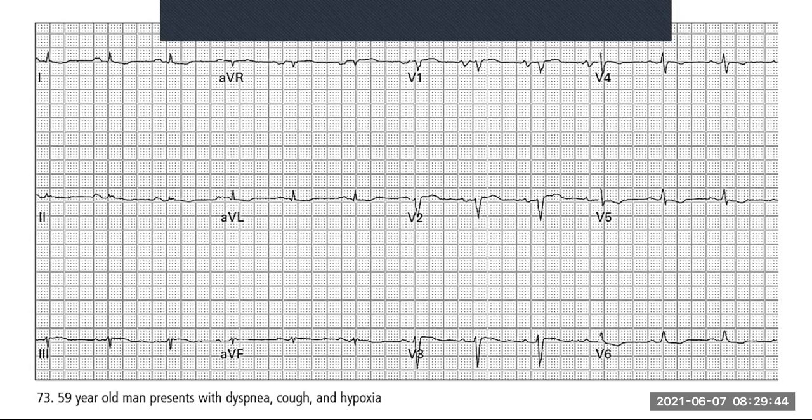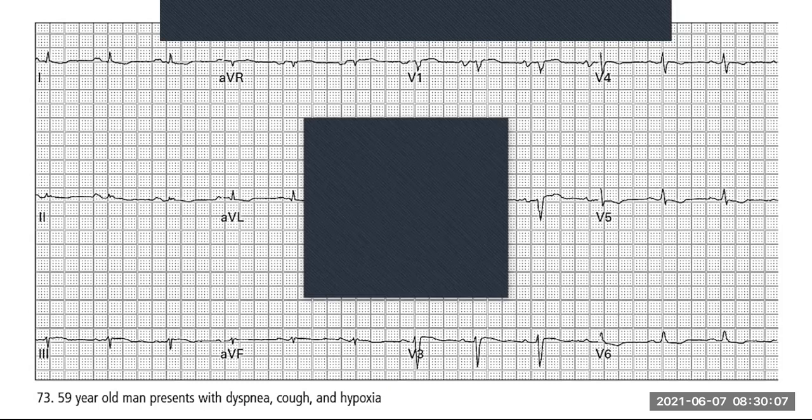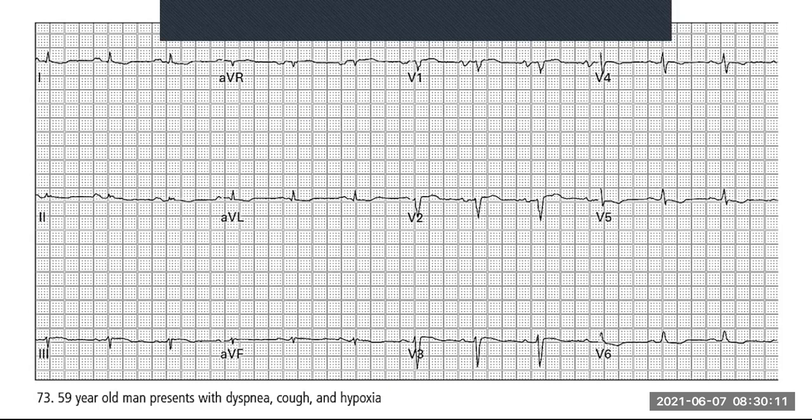So, like we say, your ECG is not the top priority. But let's just say you do end up getting the patient, you have a look, your patient's got SATs of 67, for example. Your COVID swab comes back negative. Your patient's X-ray looks weird, and the physician says, okay, we're going to admit to ICU. Now you need to do an ECG. That's probably the first time you do an ECG on this patient. But nevertheless, here's your ECG.